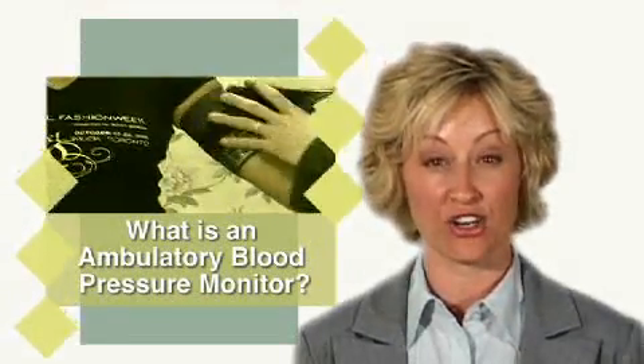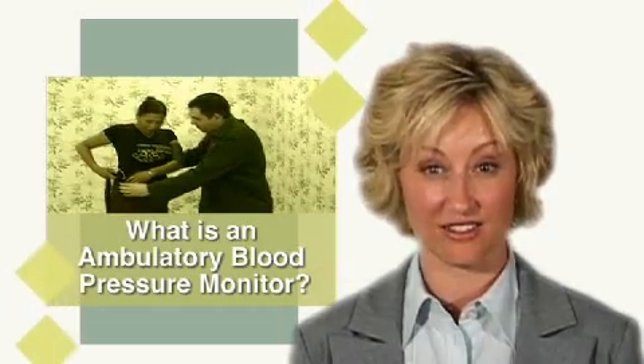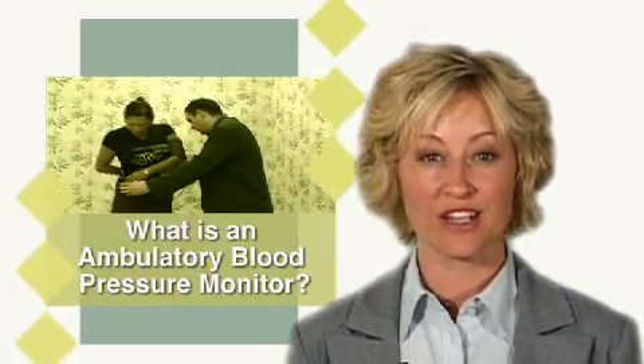The Ambulatory Blood Pressure Monitor is used to determine blood pressure responses to normal activity. During each heartbeat, blood is pumped out of the heart through the blood vessels and circulated throughout the body. The force with which the blood is pumped out creates a pressure inside your arteries that can be measured.